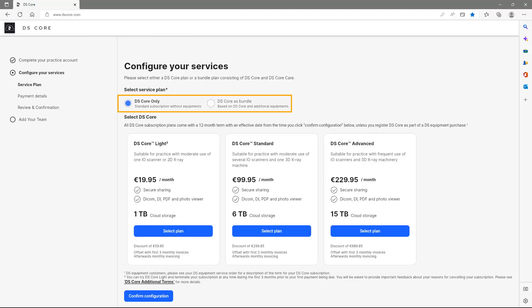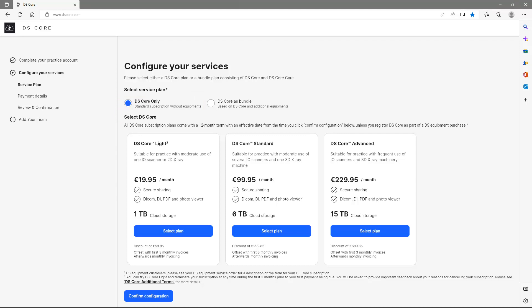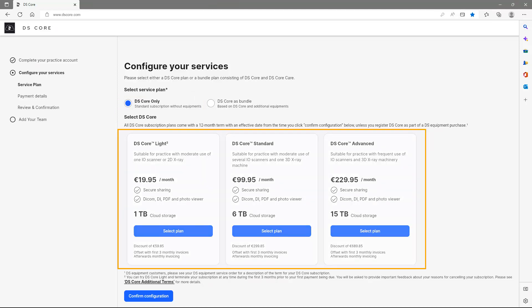Here, you select your service plan. Please choose the first option, DSCore only, in case you just want to set up an account. This is a standard subscription without equipment. Further information on the three options can be found below.